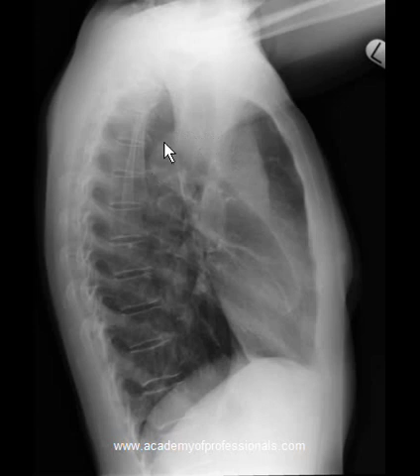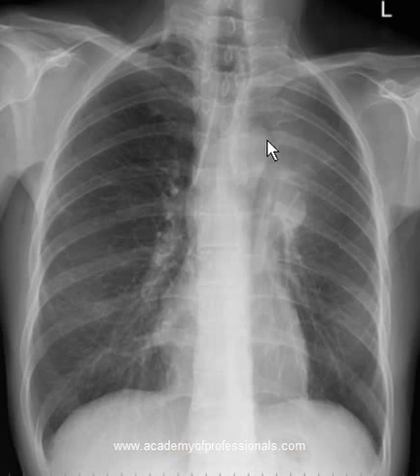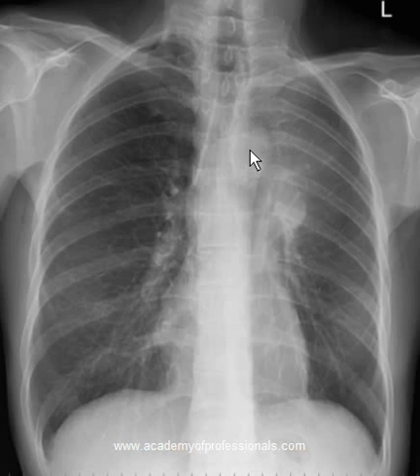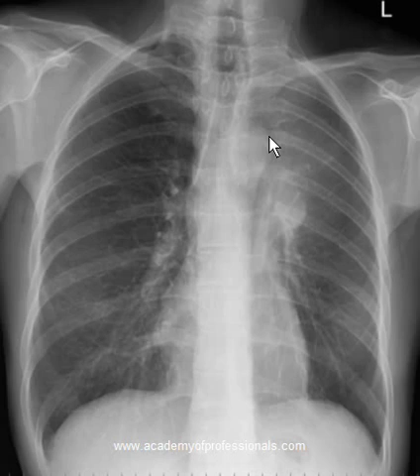This is the ascending aorta, the arch of aorta, and this portion of the aorta is visible here. Because the left upper lobe has lost its volume and air, the density is very similar to the density of the aortic knuckle, and that's why it is not as clearly visible as it should be, although there is an air density — a crescent air density — around it, which has a German name we won't go into in detail.